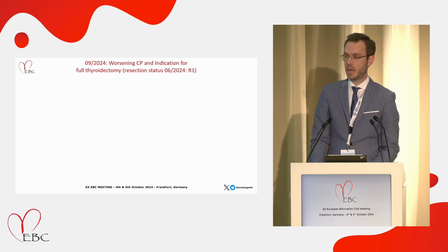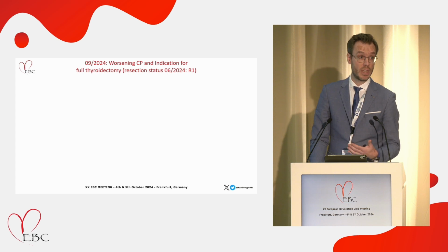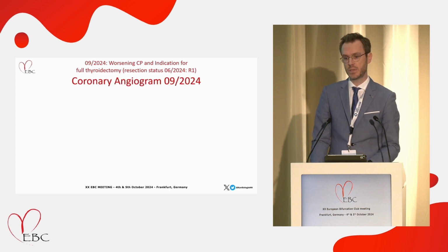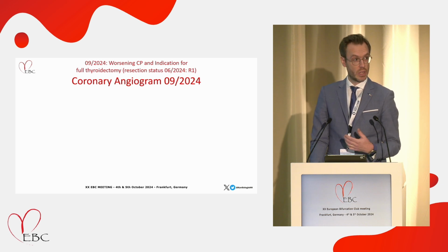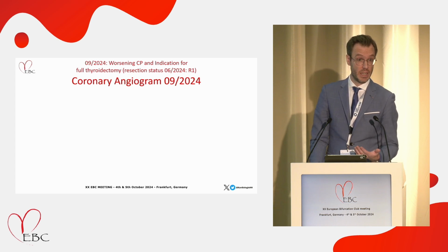After 3 months, he was readmitted to the hospital because of an R1 resection status of the carcinoma, and the surgical colleagues decided on a full thyroidectomy. When we met him, knowing he had a lesion in the LAD and D1, he complained about more chest pain and his quality of life was reduced. So we obtained informed consent to do a coronary angiogram and a physiology assessment of this intermediate lesion.